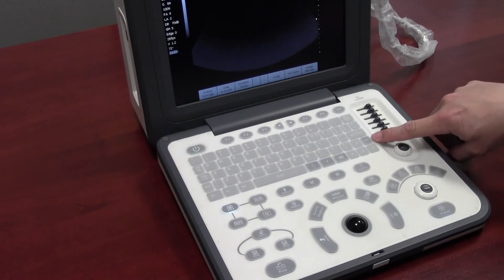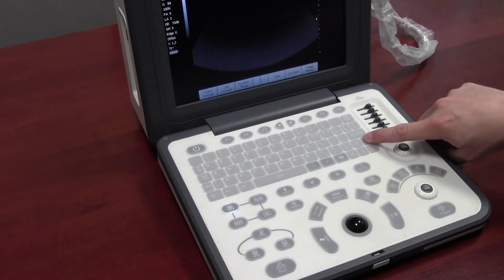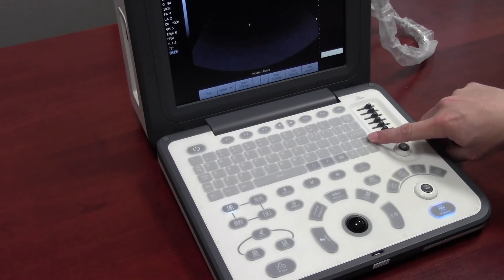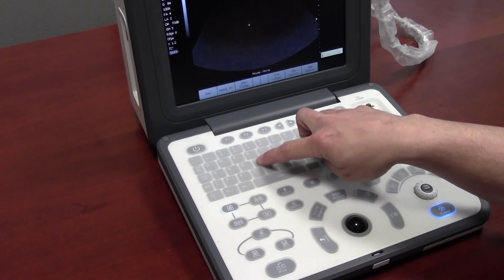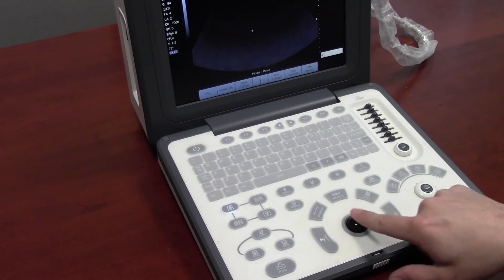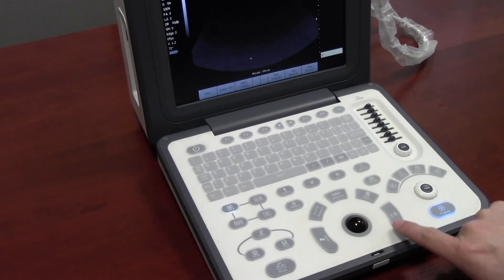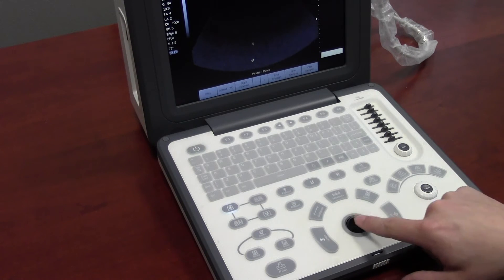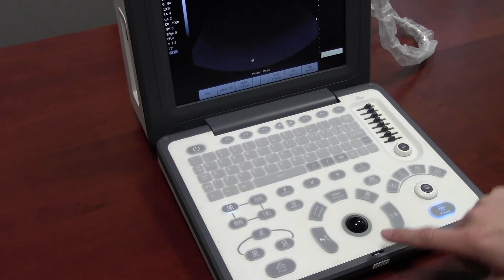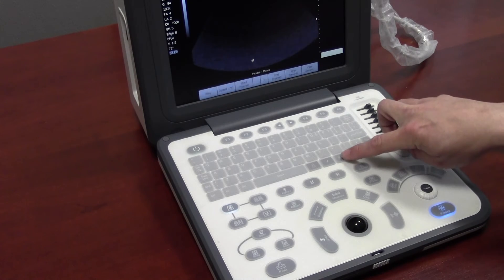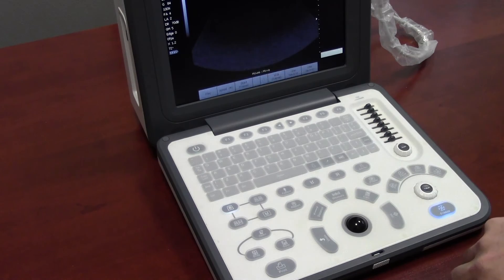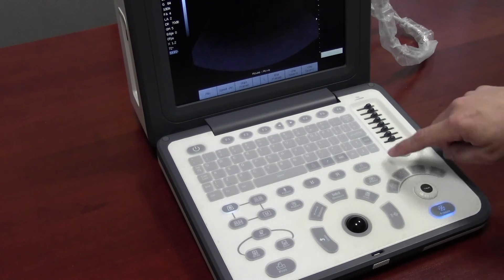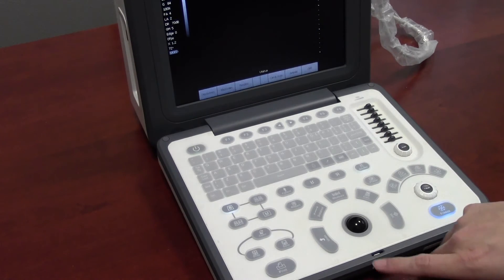You can add annotations by pressing note on the alphanumeric keypad. Type in the note that you want to put, move the trackball, and press set on the location where you want the annotation to be. To delete it, move the trackball to that annotation and press the ABC key that has a line going through it. You can also add body marks by pressing body mark.